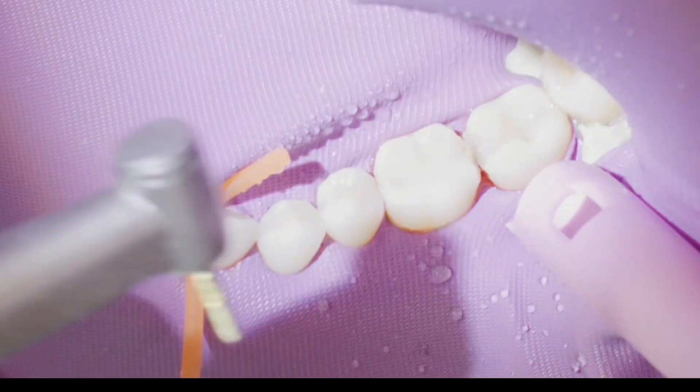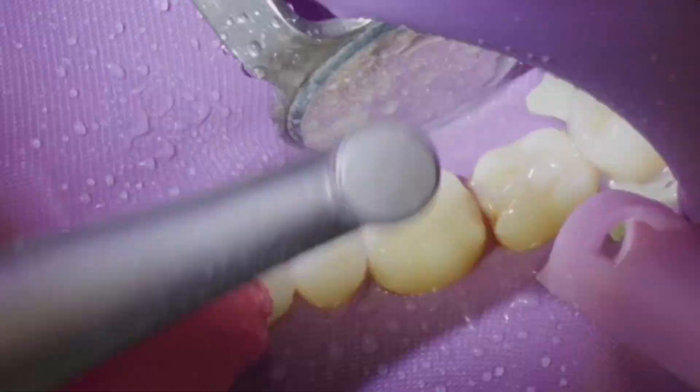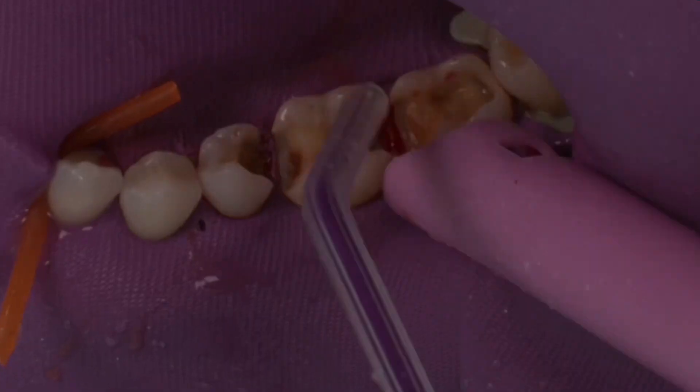I want to talk through a case I had today — a quadrant of recurrent decay around large existing and failing posterior composites. This is something I see very often, and I dread removing these and replacing them with additional direct resins because the same thing is just bound to happen again. So here I'm just removing gross caries and all the old restorations.